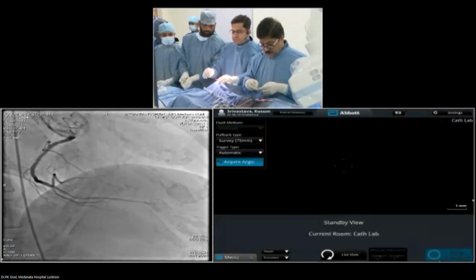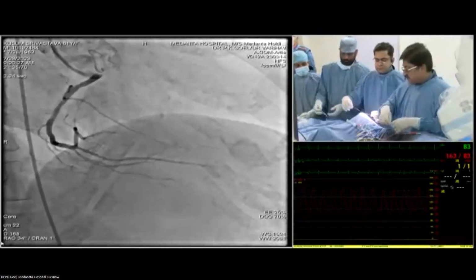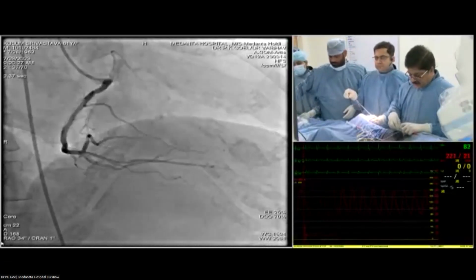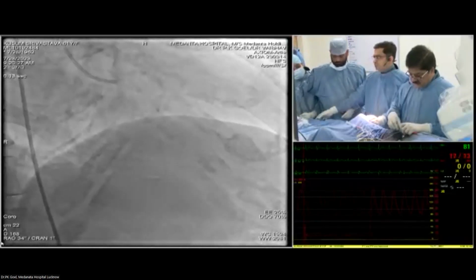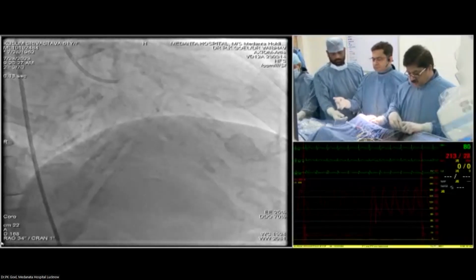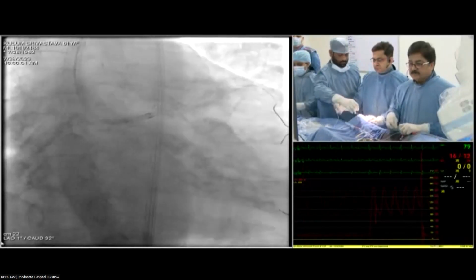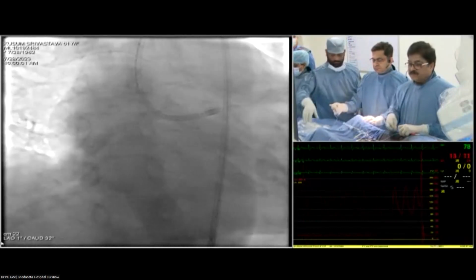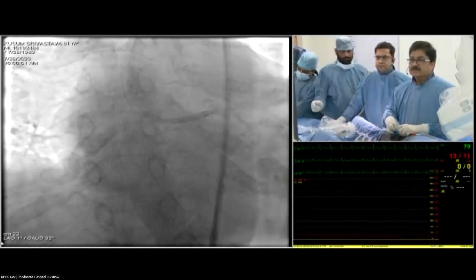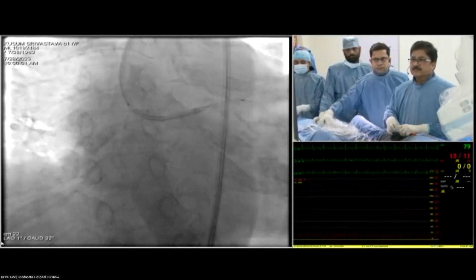I think estimating the ostial circumflex from an angle is important for deciding the strategy for the left main. Yeah. Because on the angiogram, I thought it is about 60%, and I might not leave it just like that. I might do only a provisional strategy. In the OCT run from the LAD to LMCA, it looked open. Okay, but even then, the ideal way when you plan, you do imaging, you should have imaging from both the sides. That will be ideal for planning strategy.